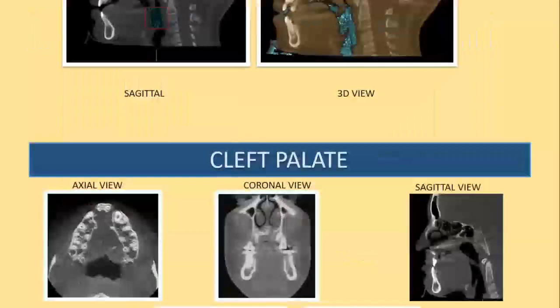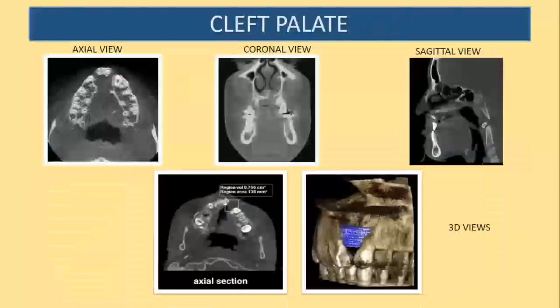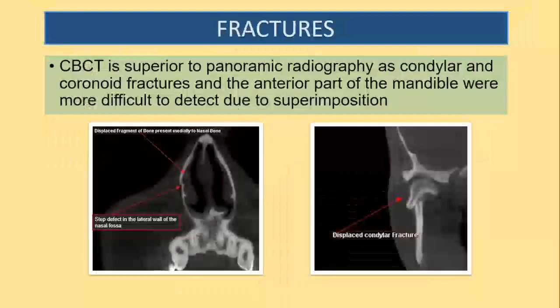Okay, same thing here for cleft palate. We mark the area saying how much volume of bone is lost there, and that will help the surgeons plan how much bone is required for placement there. Good diagnostic tool for fractures.